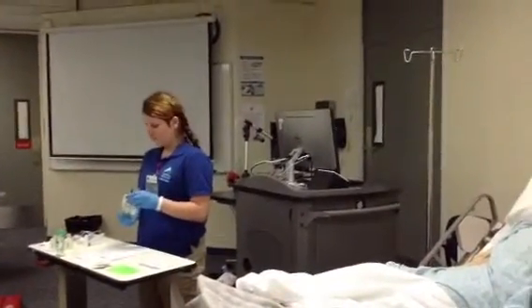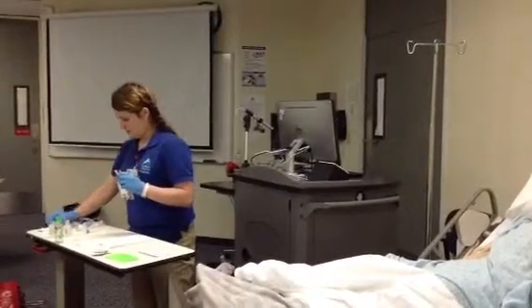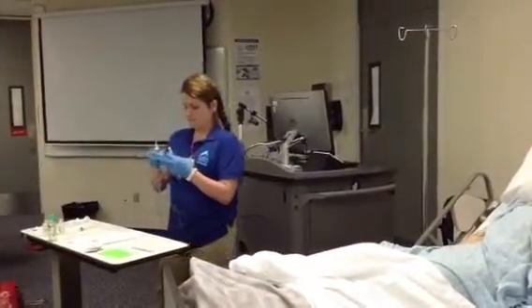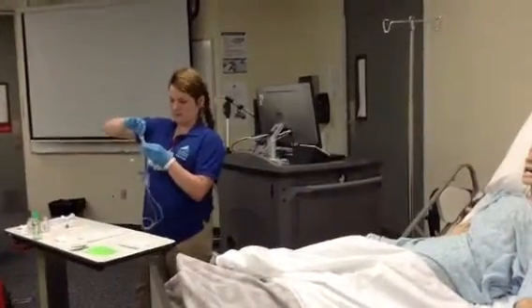I'm going to go ahead and spike my bag. I'm going to prime my chamber.